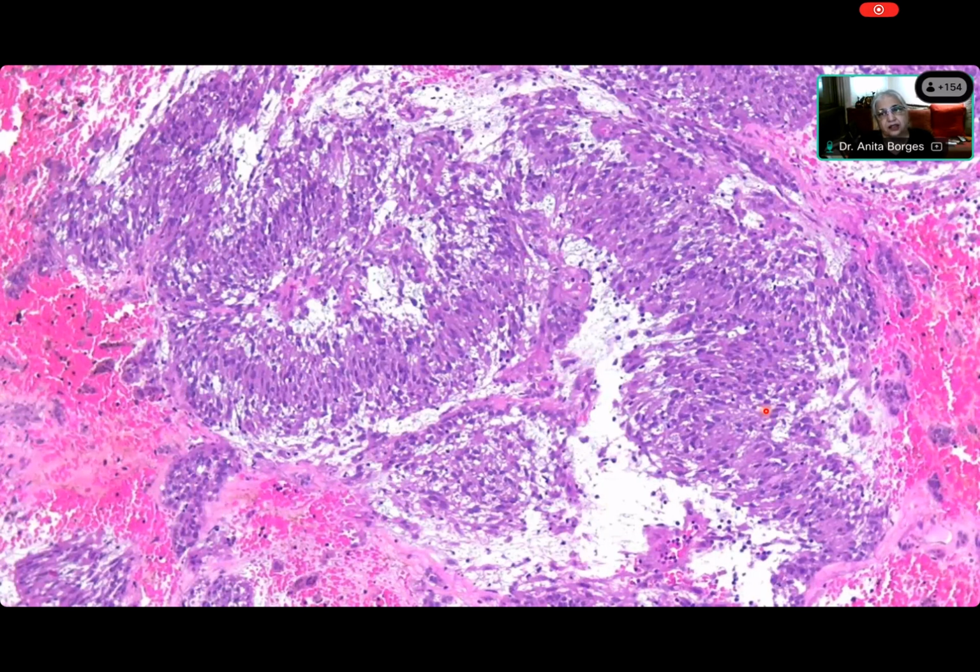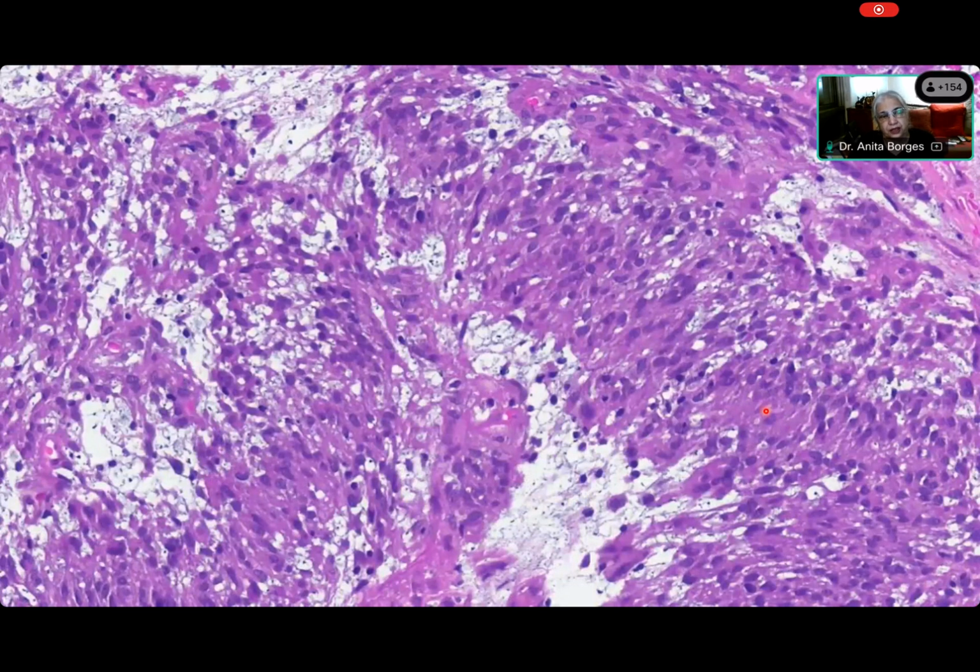So it is a spindle cell. It's a solid spindle cell tumor with palisading of the nuclei. Obviously, they're tumor cells, but you can see very nice palisading of the nuclei. It's beautiful. Okay. So why do you think there is cyst formation happening? Degenerative change. What is degeneration, Diksha? Long-standing cases may show a degenerative change or hyalinization or calcifications.